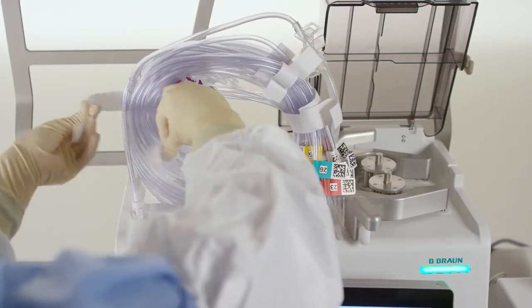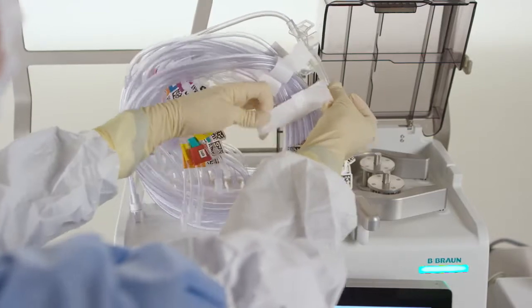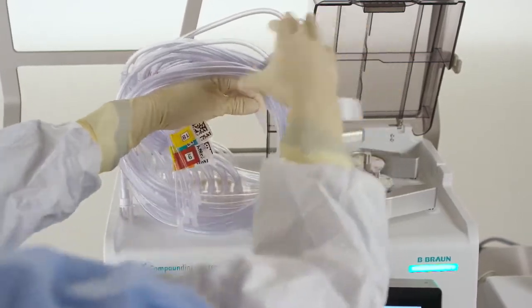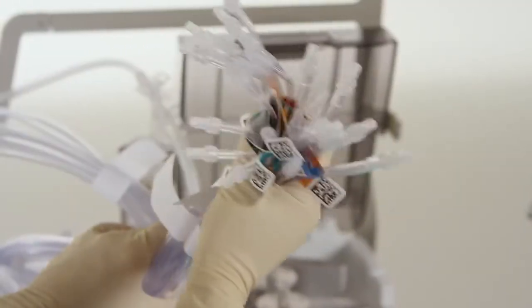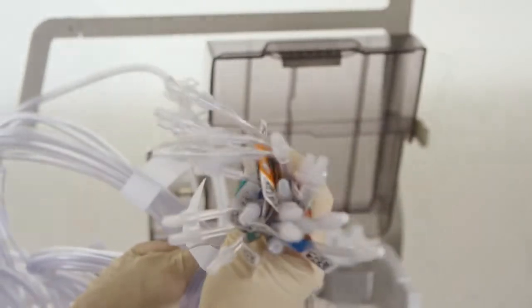Remove the two tapes that surround all of the transfer set lines. As you uncoil the lines, inspect each one for kinks and to ensure that all of the caps are in place. If any of the caps are off any of the lines, discard the transfer set.